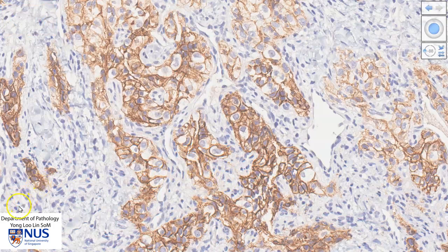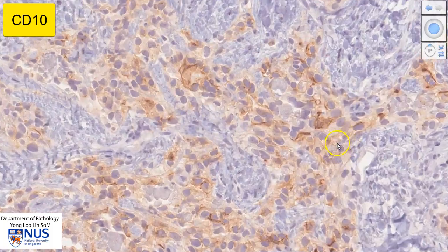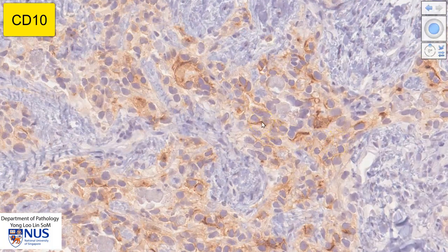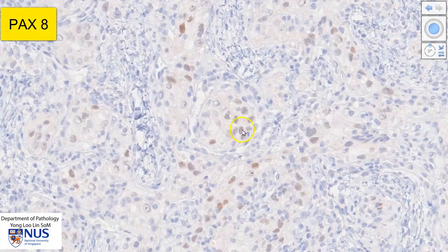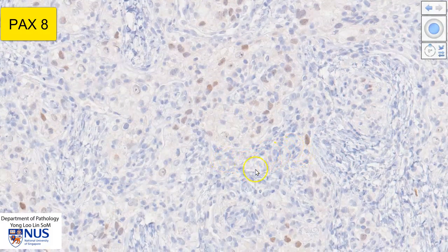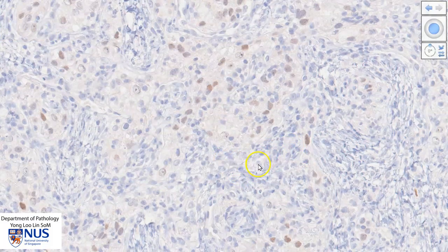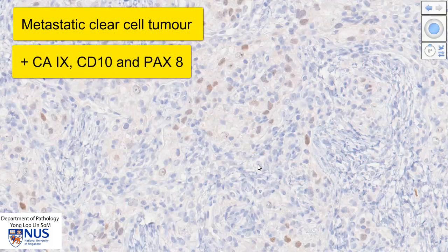Let me show you another example. This is CD10, which is another marker that is positive in clear cell renal cell carcinoma, and it also exhibits membrane staining. I will show you just one other marker. This is PAX8, and this is a nuclear marker. You can see that it is highlighting the malignant cell nuclei; however, it is negative in the nuclei of the surrounding non-lesional cells. So this particular metastatic clear cell tumor is positive for CA9, CD10, and PAX8.